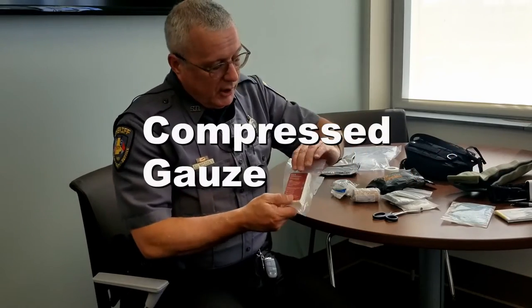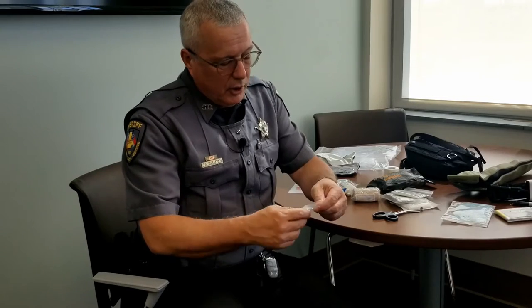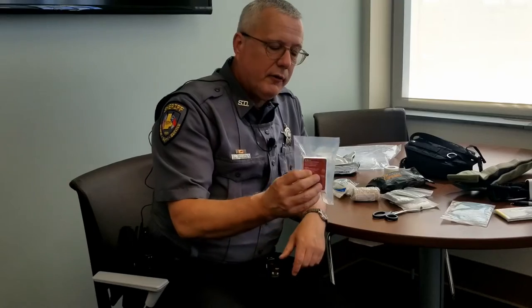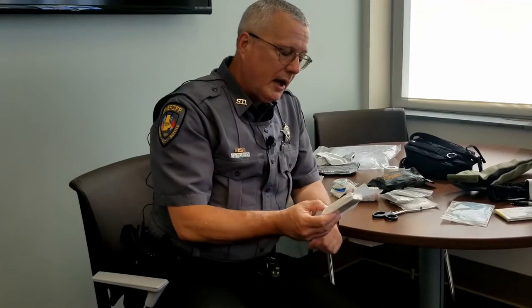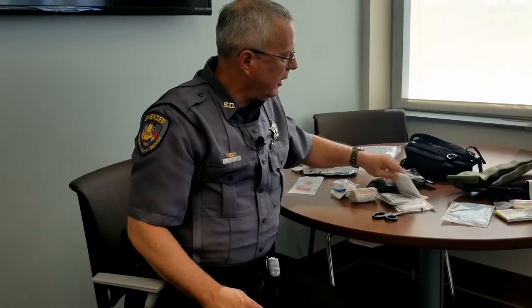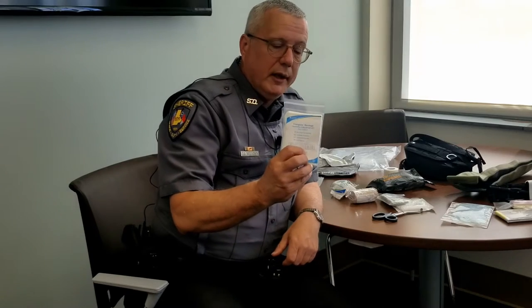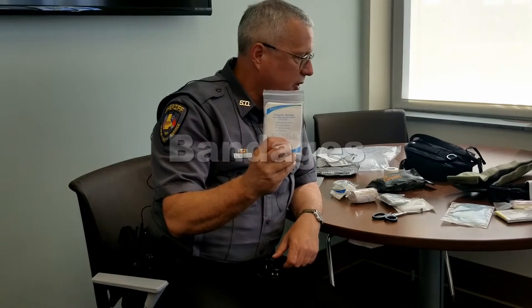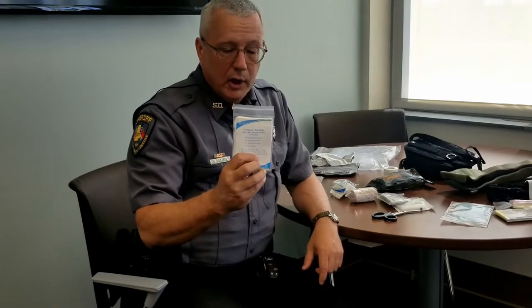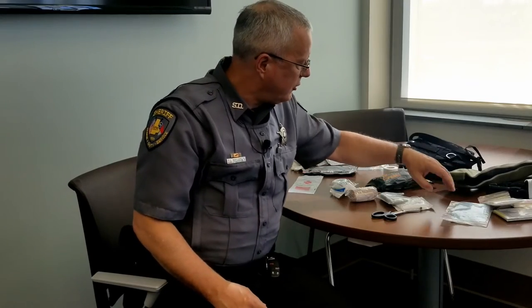This is simply compressed gauze. When you open this packet — and these things can be really difficult to open — notice where the tabs are. You open it by just peeling it off, and this will become about six feet of gauze, which can be really useful for controlling bleeding. This is a triangular bandage, useful for securing a splint to an arm, or you can use it as a makeshift sling for an elbow fracture or something of that nature.